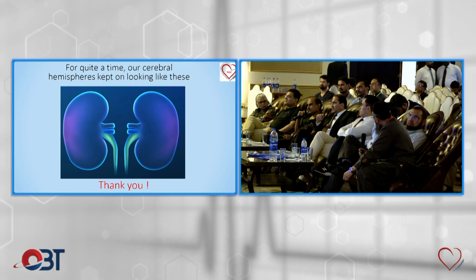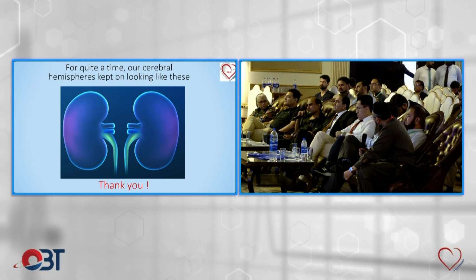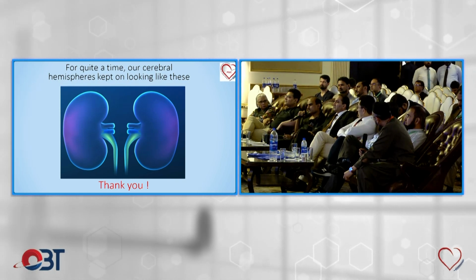We have StentBoost in only 1 of the 5 main cath labs. There are 2 primary, total we have 7, but we have StentBoost in only 1 of them. And this patient was done in a cath lab which did not have StentBoost at that time, unluckily.